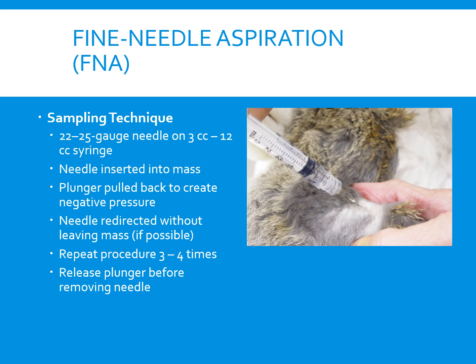The size of the syringe that is used is influenced by the consistency of the tissue being aspirated. Softer tissues, such as lymph nodes, often may be aspirated successfully with a 3 ml syringe. Firm tissues, such as fibromas and squamous cell carcinomas, require a larger syringe to maintain adequate suction for the sufficient collection of the cells. Because the ideal size of the syringe is not known for many masses before we aspirate it, a 12 ml syringe is a useful size because it's somewhere in the middle.